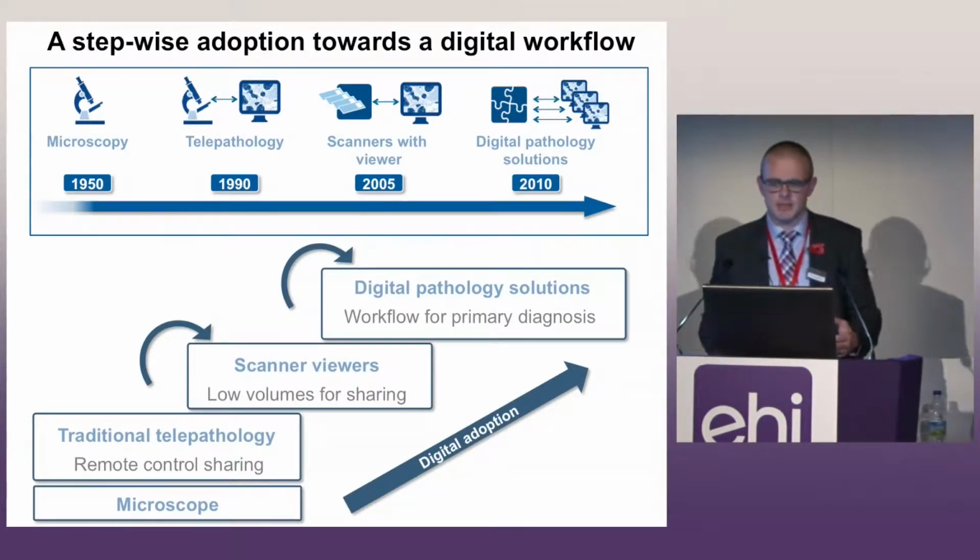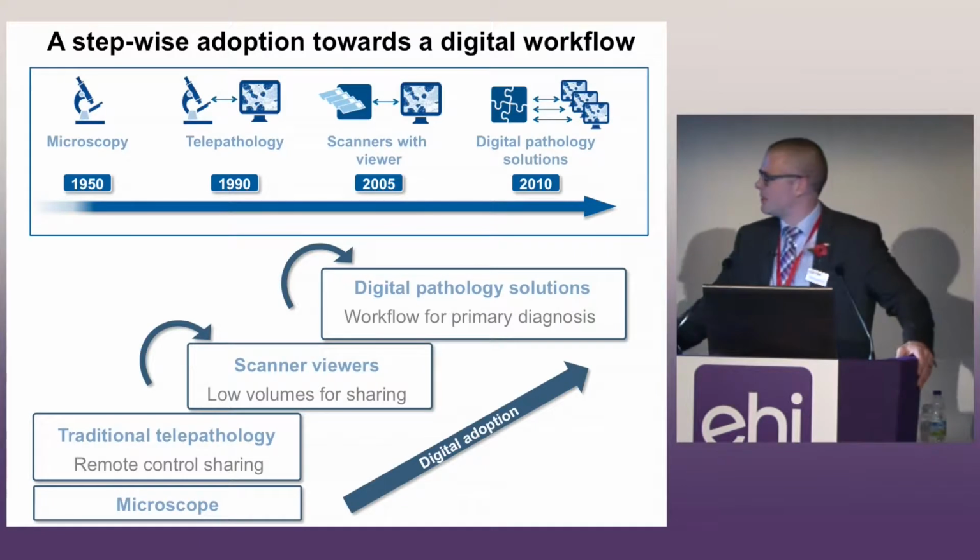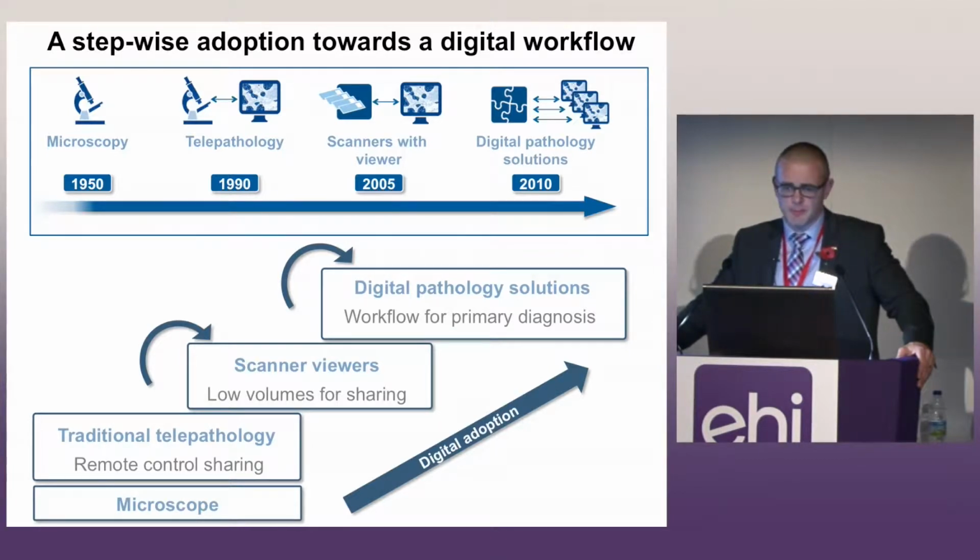So where are we in terms of the adoption of digital pathology? Well, way back in the 1950s, the microscope was brought to the enterprise, and that pretty much remained for 40, 50 years.